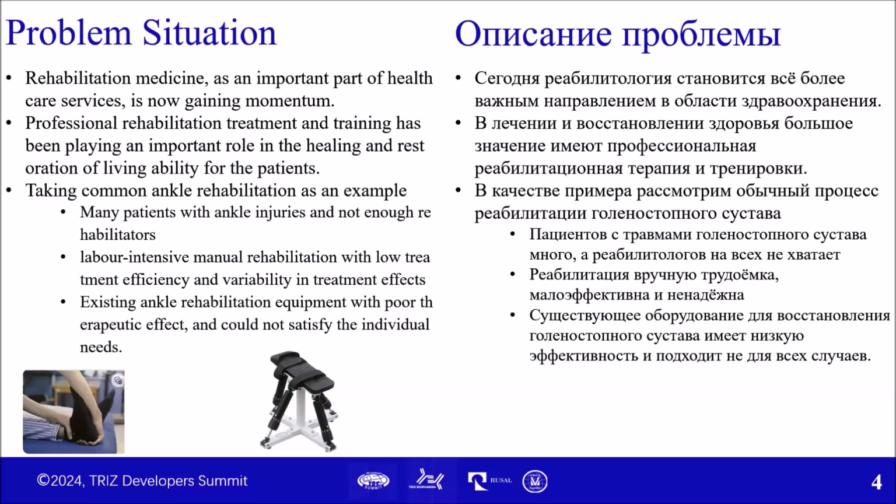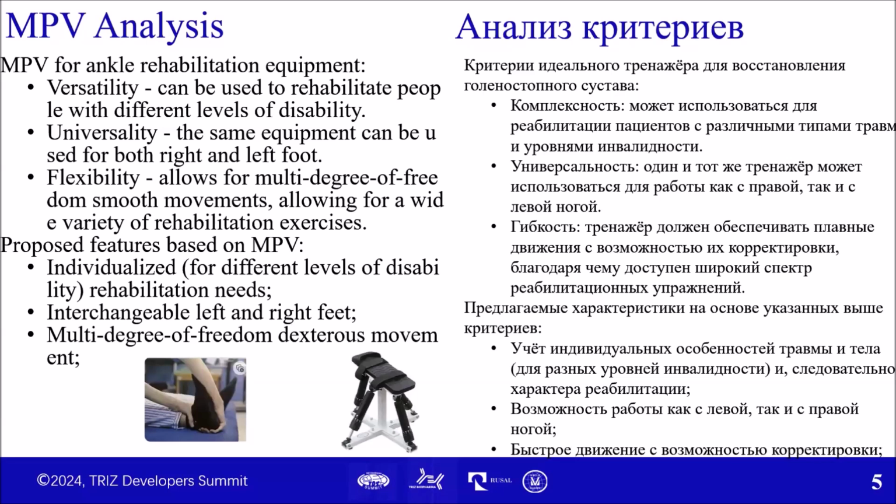Existing ankle rehabilitation equipment with poor therapeutic effect that couldn't satisfy individual needs. After defining the object of study and the problem to be solved, further analysis is needed.